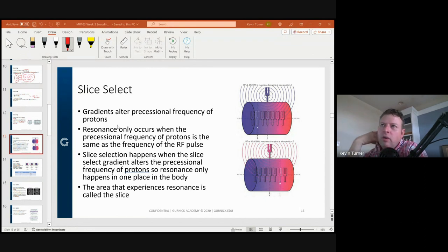As we get further into our talk about MRI here, we need to start considering the different domains that we're looking at. Sometimes we're talking about what's happening inside of the magnet with the patient, and sometimes about what's happening on the image inside the computer. So we have what's happening in the patient and what's happening inside of the computer, and how those two things translate to each other.